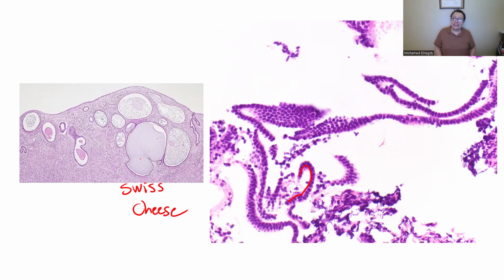The dilated cystic gland with atrophic lining and atrophic surface epithelium. The atrophic epithelium have scant cytoplasm and very little, and it's nearly as if they are a monolayer of nuclei beside each other. And then you might see some endometrial glands falling off, and they are curved like paper clips. That's atrophic endometrium, or what you said, inactive endometrium.